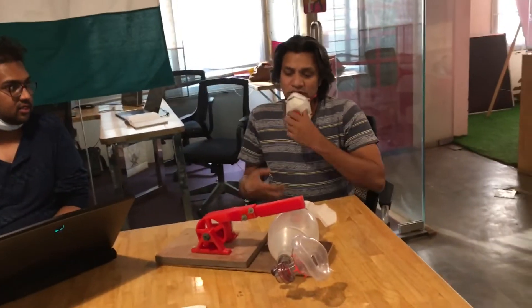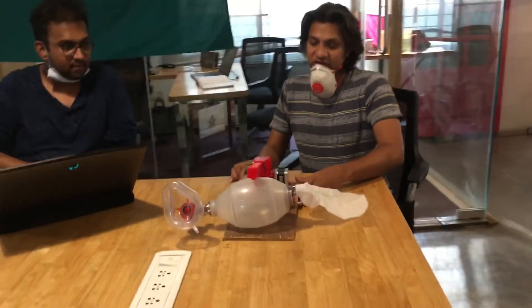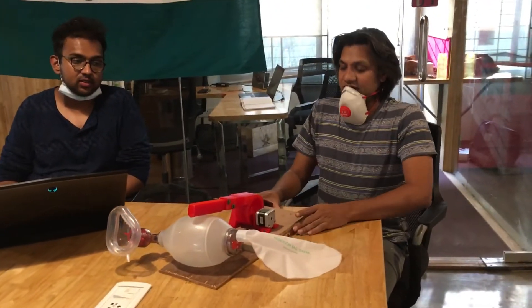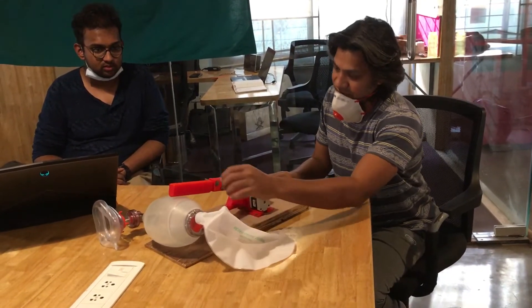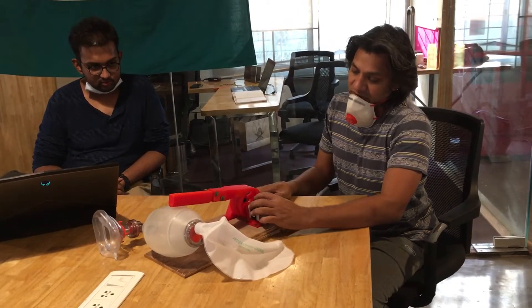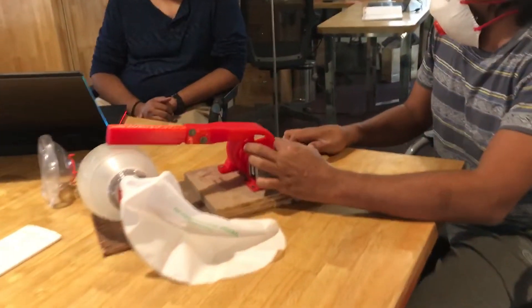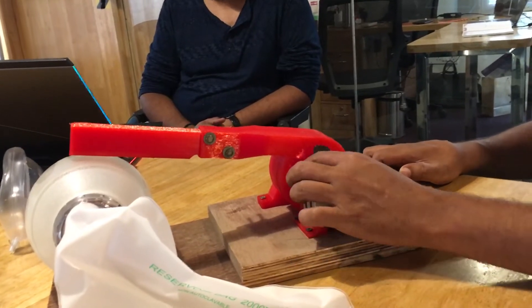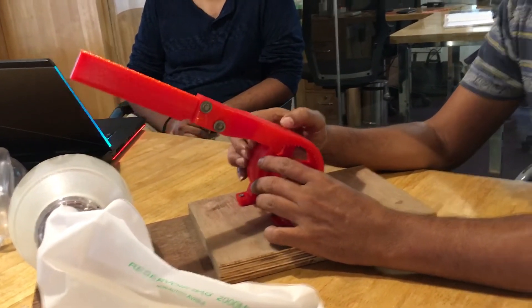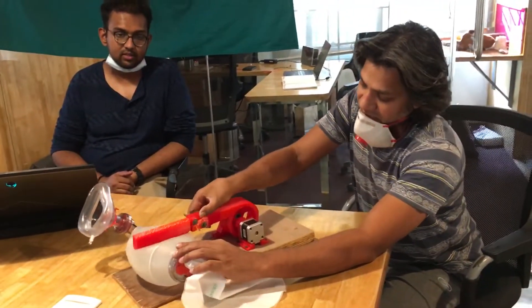As Vishnu mentioned, this is all 3D printed and designed in-house by Vishnu. The basic concept is that there's an arm activated by the stepper motor. There's a gear which sits on another gear, and through electronics the stepper motor controls this arm, applying pressure on the BVM to deliver breaths.